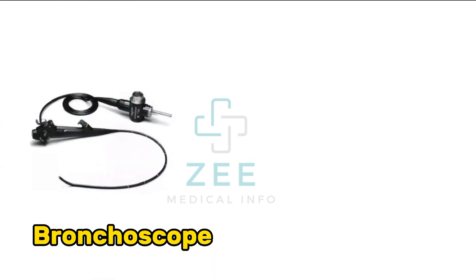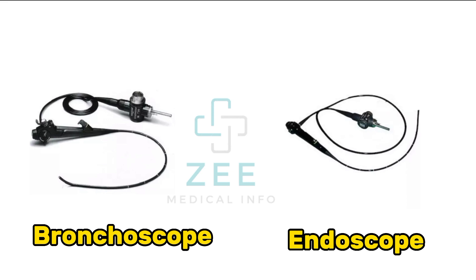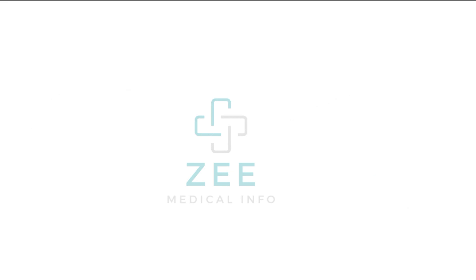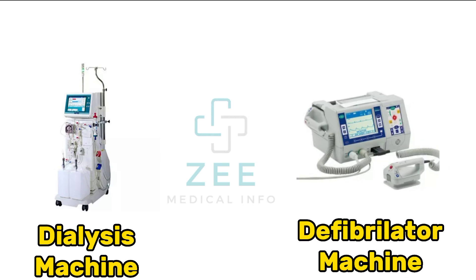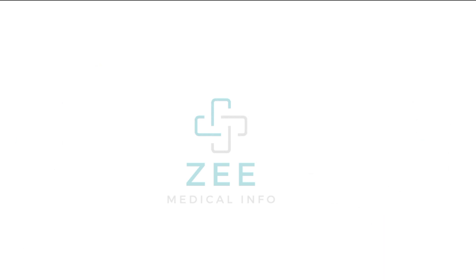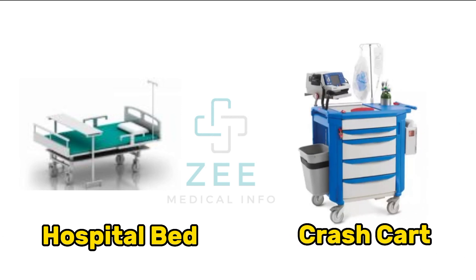Bronchoscope, endoscope, dialysis machine, defibrillator machine, hospital bed, crash cart.